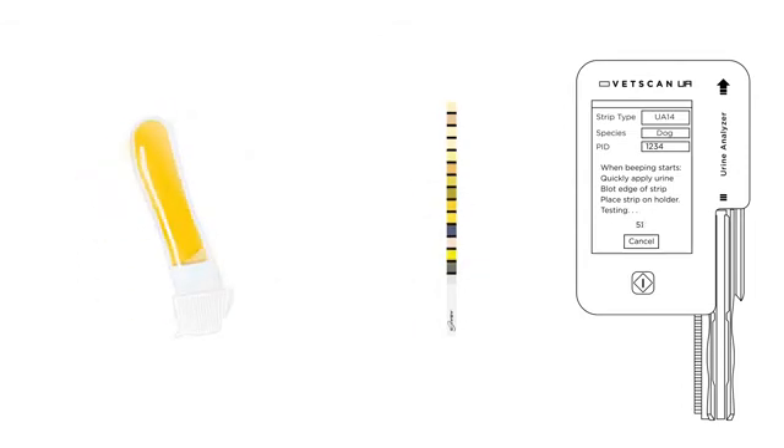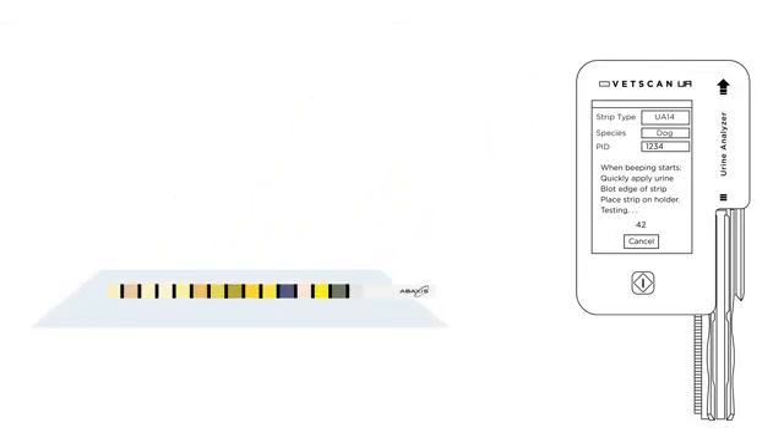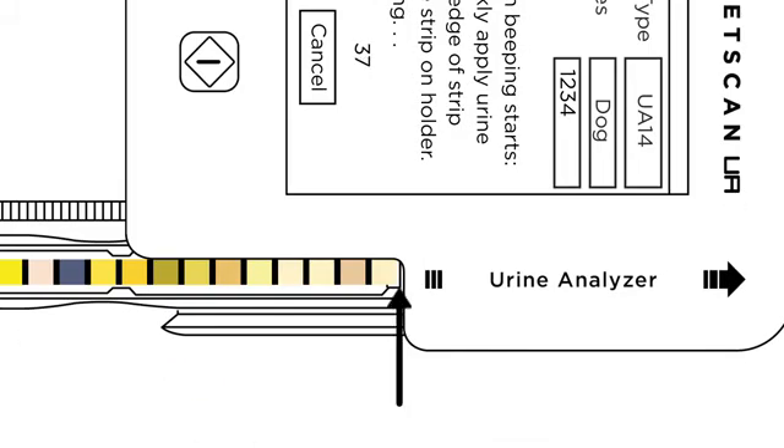Mix the fresh room temperature urine sample before applying it to the strip. Apply urine to the test strip by immersing all the pads into the urine sample or using a transfer pipette to drop urine on each pad. Blot the strip on the long edge to clean absorbent paper to remove excess urine. Place the UA strip on the strip tray with the end of the strip at the edge of the analyzer opening.